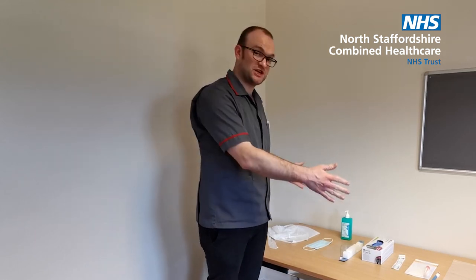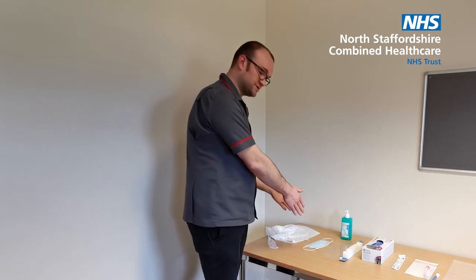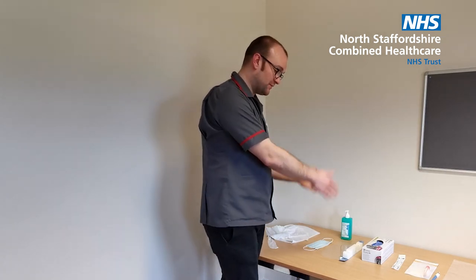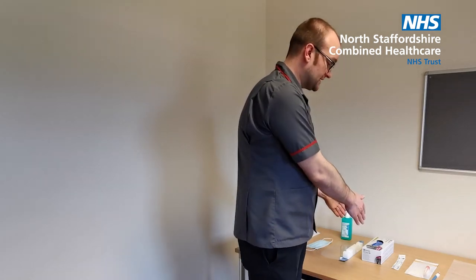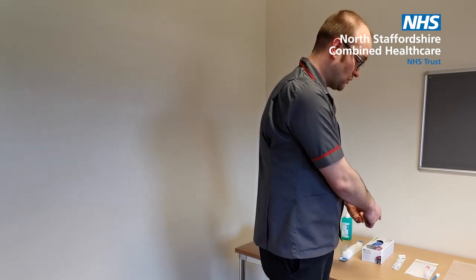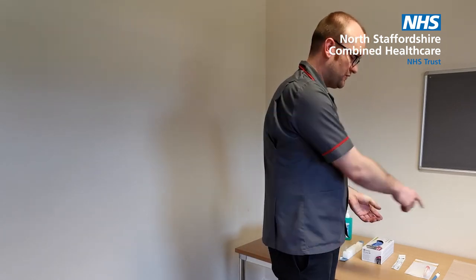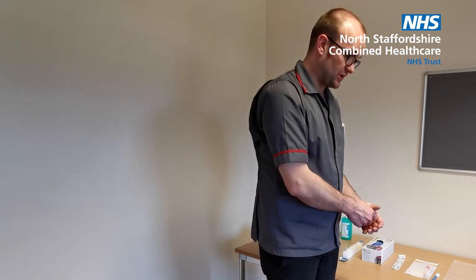So first of all, you need to make sure you've got all the equipment ready, laid out at your station. So we've got an apron, we've got a fluid-resistant surgical mask, we've got eye protection — be that face shield or goggles. We've got a set of gloves, depending on what size you need. You've got your swab with your transport medium, you've got your virology request form, you've got your double bag, and don't forget that you need your pen.